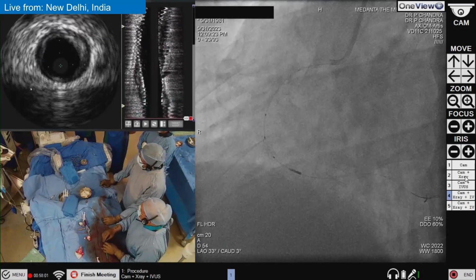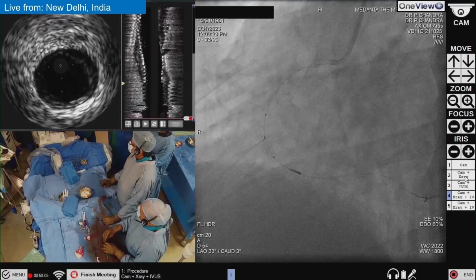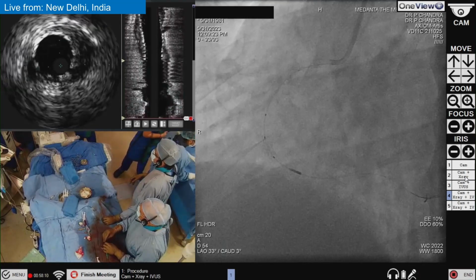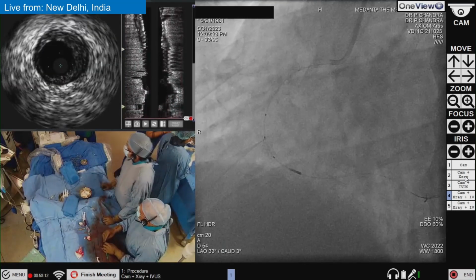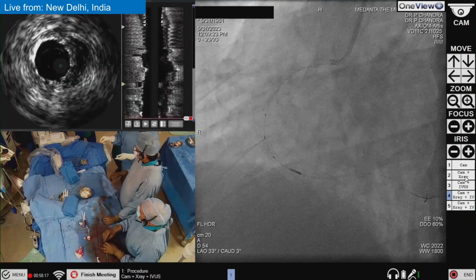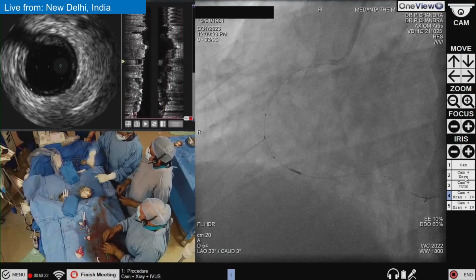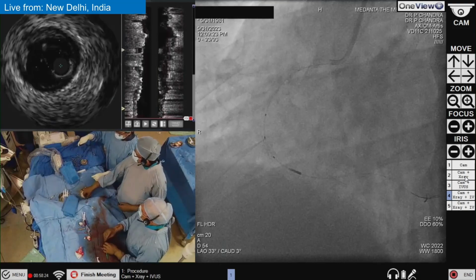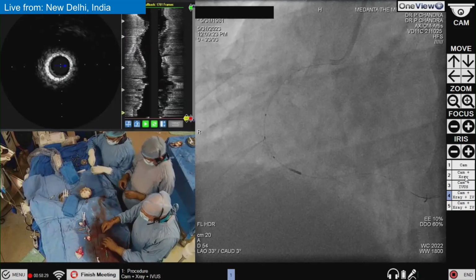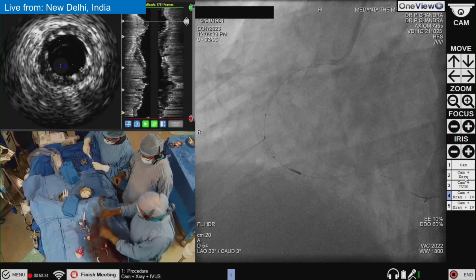Yeah, this is perfect. So the proximal and distal edge is perfect. Yeah. We can now see the second stent. Again, there is no dissection, the distal edge, and the position is perfect. We are landed in some plaque, so it's acceptable because the expansion is good. The lumen area is quite good. So this expansion is better, actually. It's quite good. So we can do the same post 3.5 balloon. That's all. So overall looks almost done.